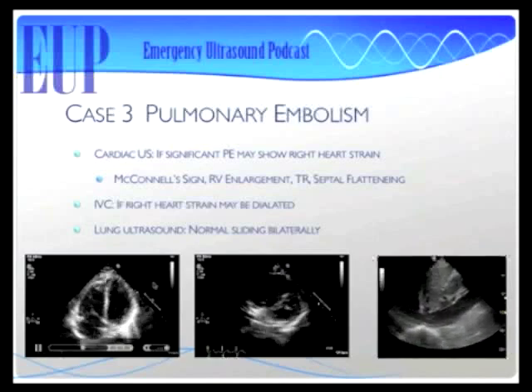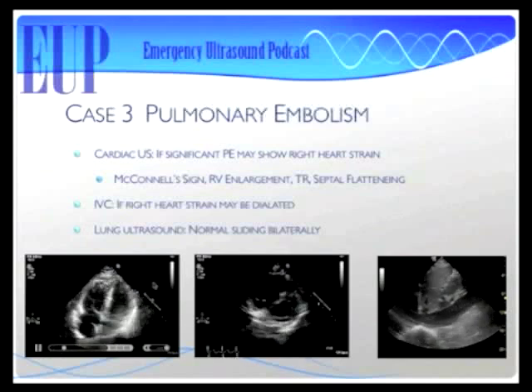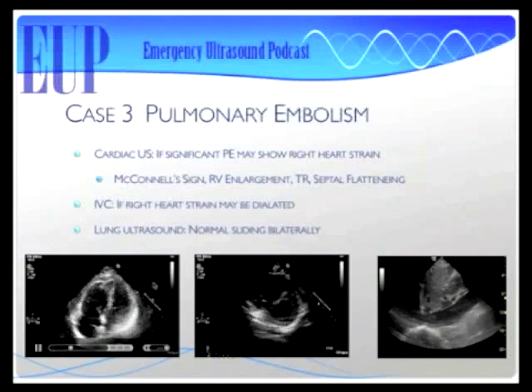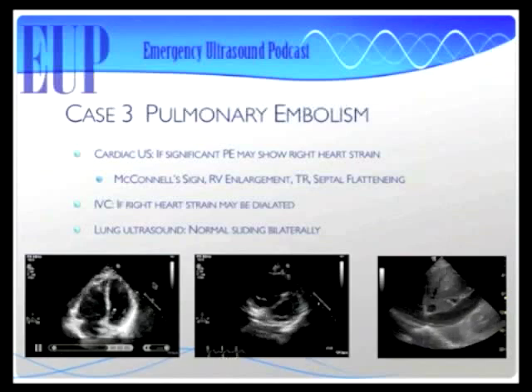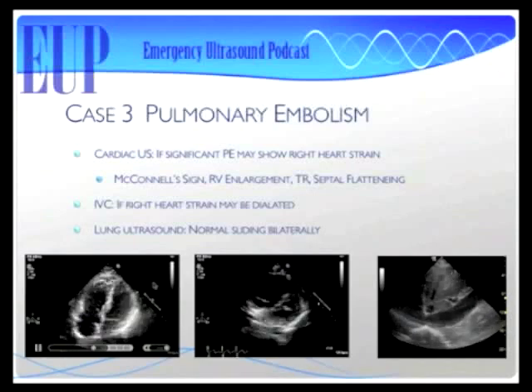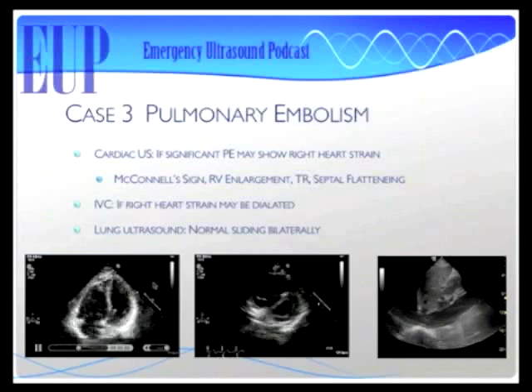Or is it something completely acute? If you see this in a 20-year-old with no history of pulmonary hypertension, and they recently had surgery and they've got a big inflamed leg that looks like it's got a huge clot in it, then if you're going to make bets, okay, you're going to roll the dice. So if your patient is crashing, and you're trying to decide lytics or something else, then you're saying this could help. If my patient were crashing and they had this ultrasound, as long as they didn't have a contraindication, I would probably be pushing lytics. Okay, just on the ultrasound.